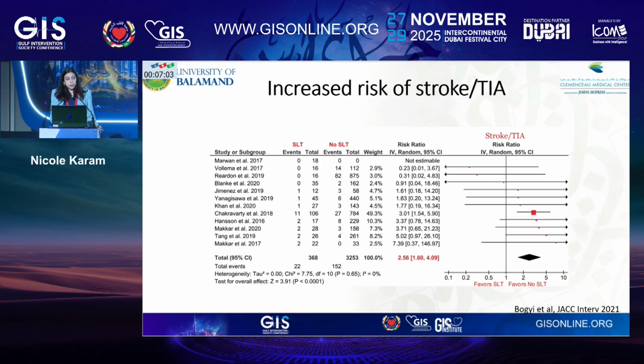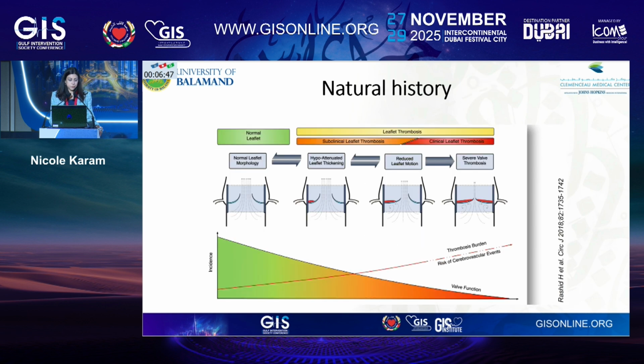So what's the impact of SLT? There is an increased risk of stroke. I didn't go through individual studies because we have this meta-analysis that was pretty inclusive, and we see that there is more stroke or TIA in patients who will develop HALT.